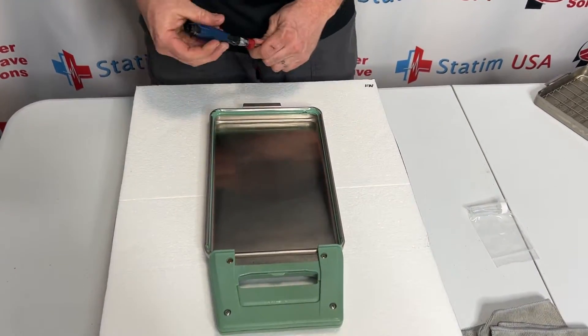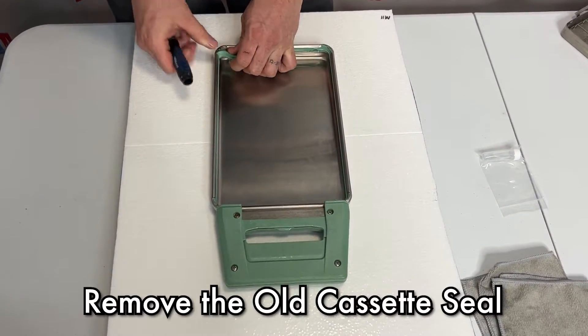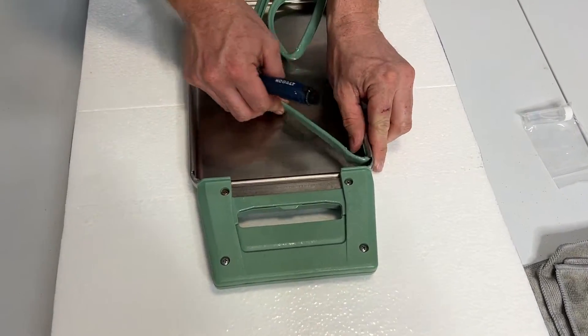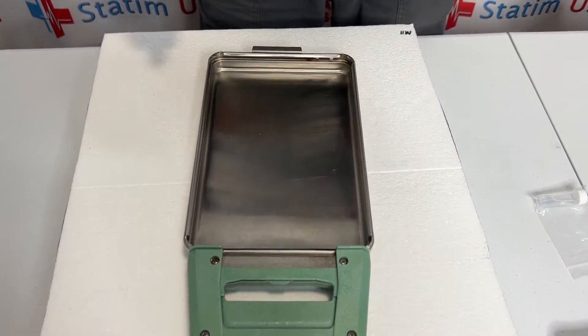I'm going to use a flat head screwdriver and we're just going to dig down around one of the corners and it should pop that seal out. Once that seal's out, we're going to set that off to the side.